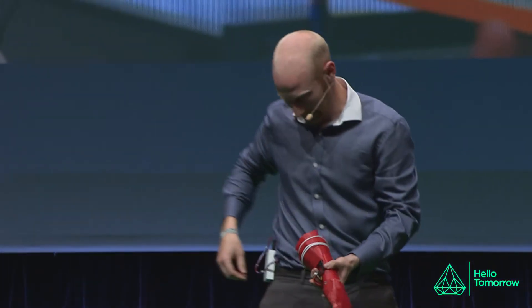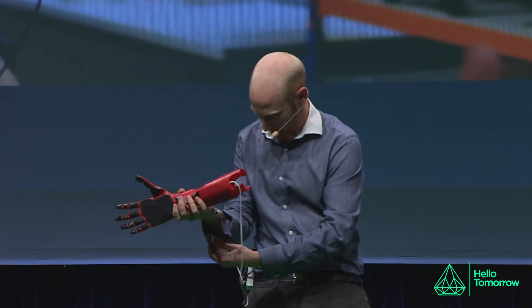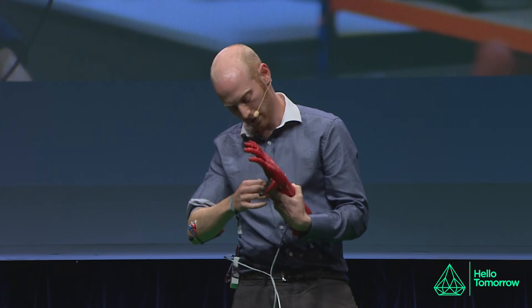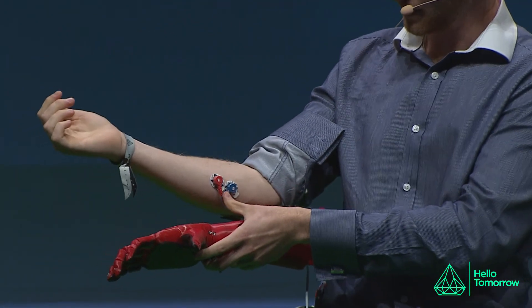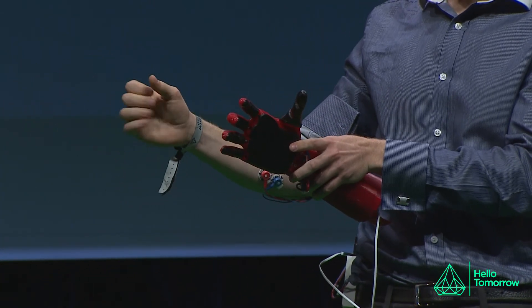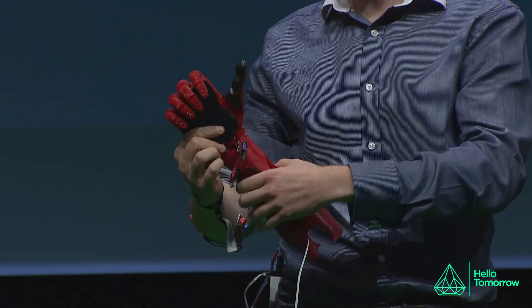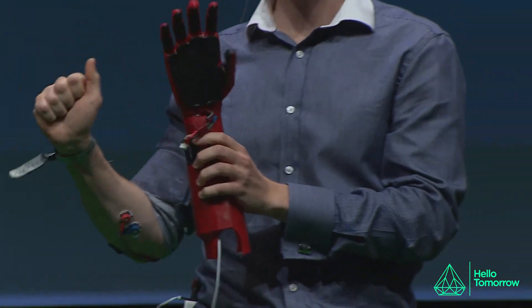I'll finish with a quick demonstration of our latest prototype. It's being controlled by myoelectric sensors — the same way an amputee would control it. Despite having lost their hand, so long as it's below about the mid forearm, an amputee still has the muscles that would have controlled their fingers and wrist, so they can operate this in a really intuitive way. We can change different grip patterns and open and close the hand. The hand is completely 3D printed, and this socket was printed to fit Dan — so this is actually his hand I've borrowed. Thanks very much.